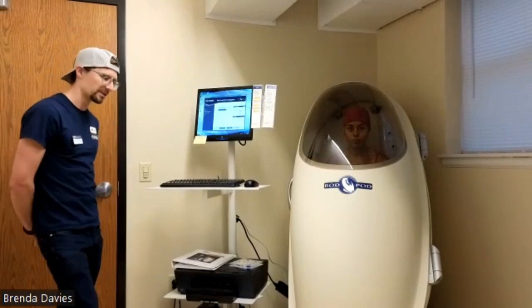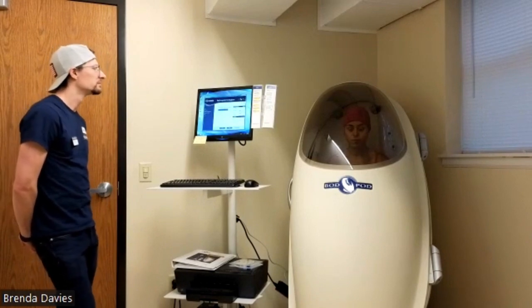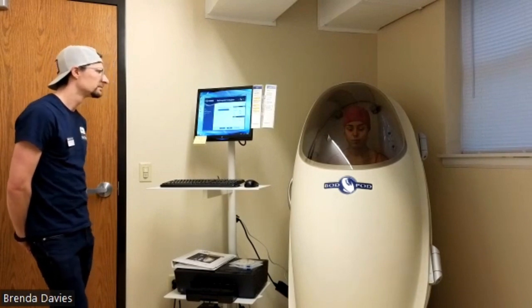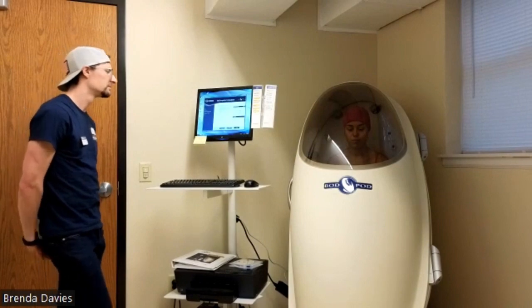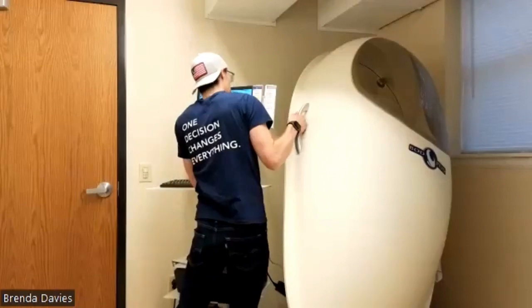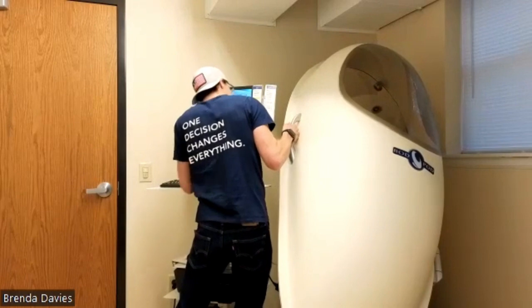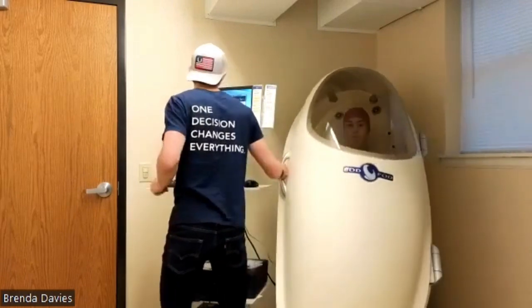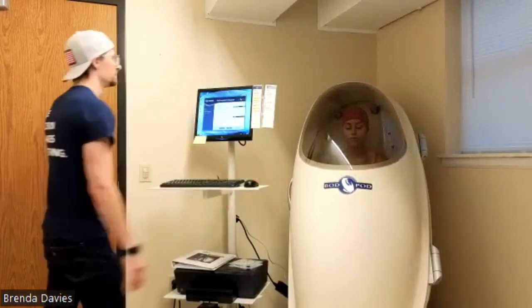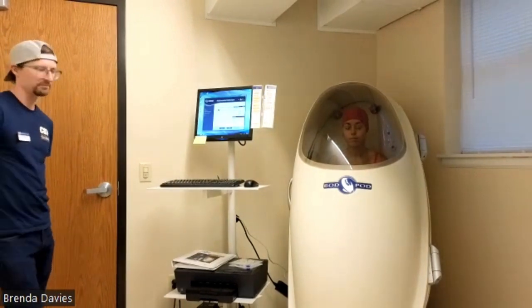But there's a newer ultrasound technique that does basically the sites of a skin fold test, and it does ultrasound instead of the skin fold pinches. And what it does is it calculates the waves and the differentiation there. And so she was comparing if it was accurate to the Bod Pod in a healthy, active female population, because previous research has shown it was less accurate with a female active population.